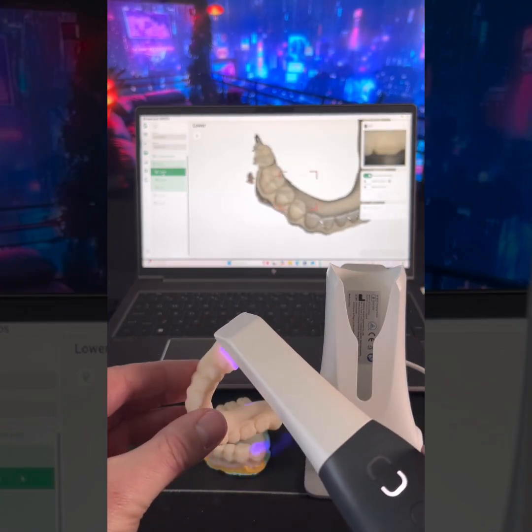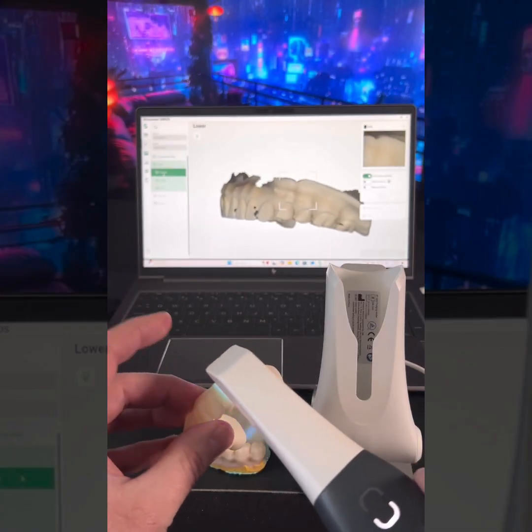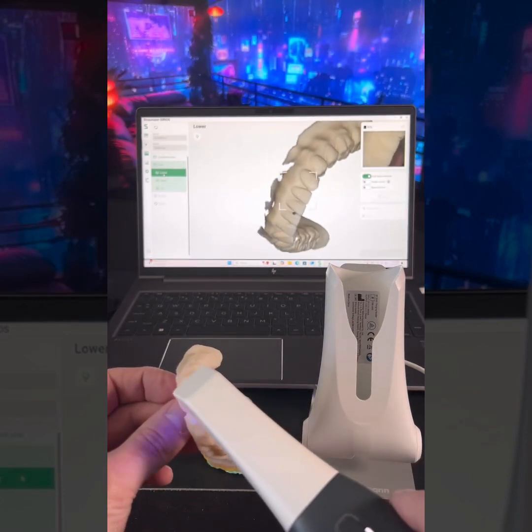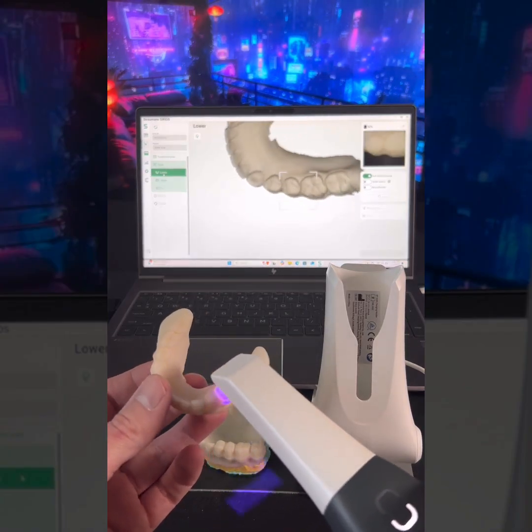I've scanned before with other scanners, but putting this one to the test with something that's usually somewhat hard to scan. Just get all my teeth in there. That looks pretty good so far.